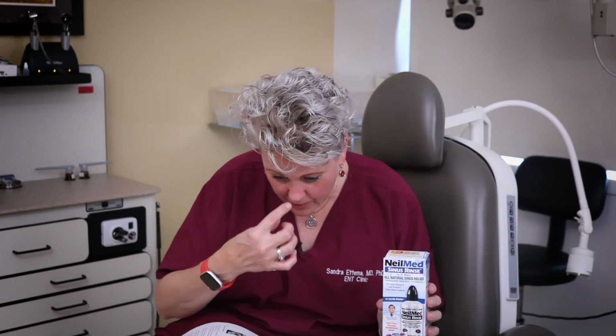And when you sing ah, the dangly thing in the back of your throat goes up to close off your nose, and the water will stay in your nose and it'll go up one side and come out the other. And it won't go down your throat and gag you, which is what people usually don't like about doing the nasal sinus rinse. So if you sing ah, then you will be an expert at it. And I even have kids do it. I have kids down to actually 3 years old who do it.